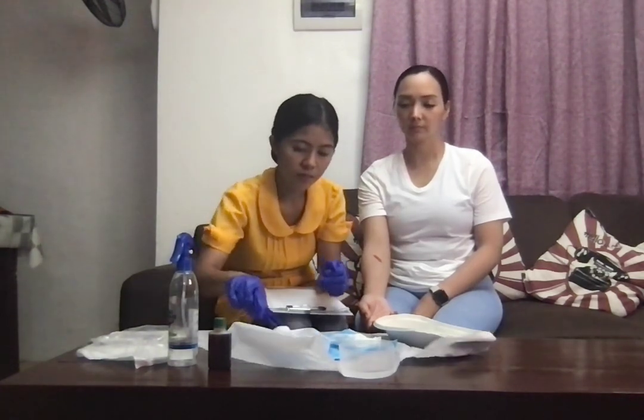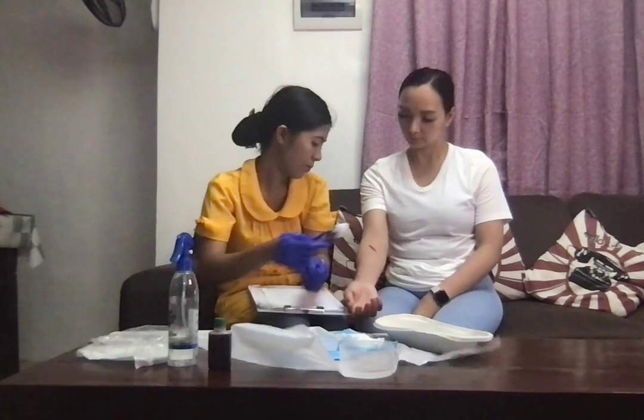After that, I'm going to clean the wound. I'm going to clean the wound from top to bottom and from the center to the outside. Following this pattern, I'm going to use a new gauze for each wipe, placing the used gauze in the waste receptacle alternately, and I'm going to irrigate the wound from top to bottom with an irrigating solution or commercially prepared wound cleanser. Ma'am, i-clean ko lang po.